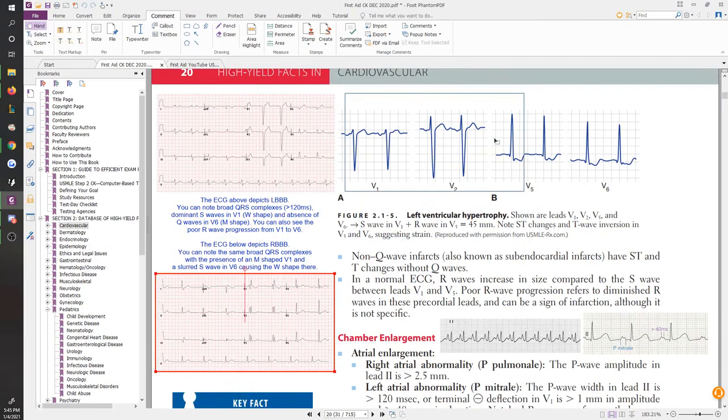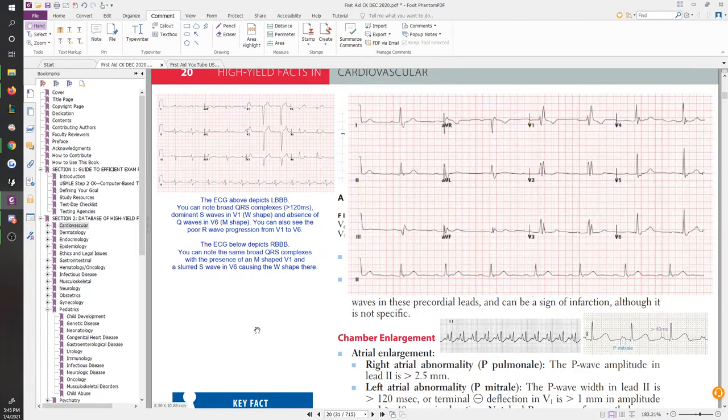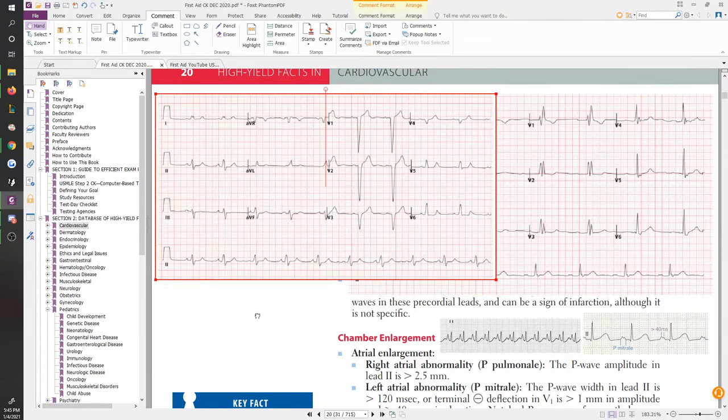So this next one here is supposed to be the other side. This is a right bundle branch block, so that's going to be your Marrow. Here, thankfully, it is very clear. As I was saying, compared to here, let me make them both equally as big so you can kind of see. I'm going to hover. If we're comparing the V1 here to the V1 here, you can instantly see that on the left one, the V1 does definitely not have an M. There is no M there, so it cannot be a right bundle branch block. The M is very clear on the right ECG that I'm hovering over there.